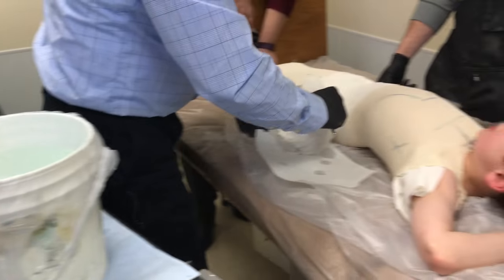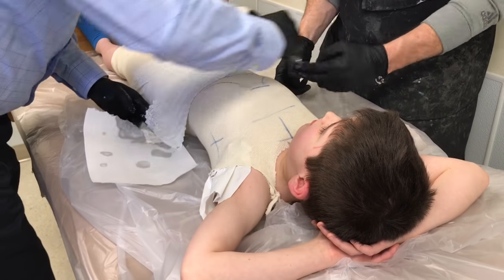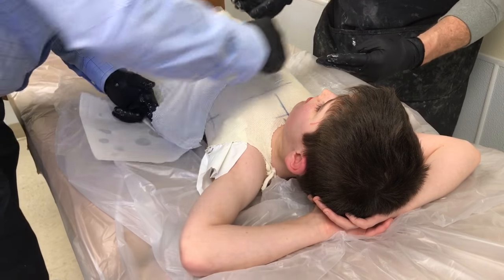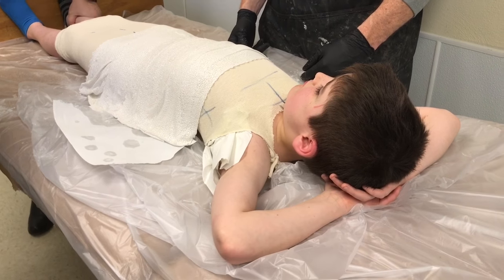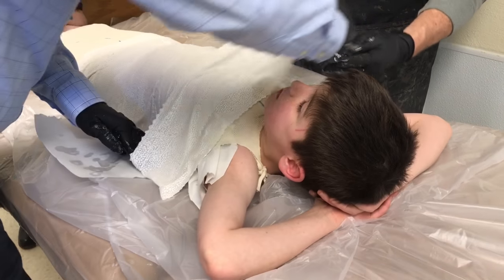When will it be tight? Ow. It's not painful — it's just laying over your tummy. It's fine. Just relax, don't worry, we've got you. How does it feel, Zach? A little bad.